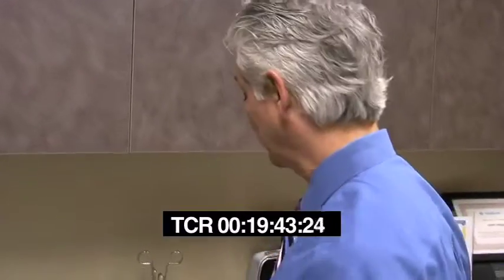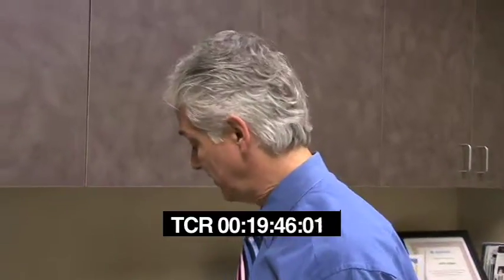Gotcha. Now, what's the ice for? The ice is for after we finish using the machine, it's pretty hot. Okay. We actually also use a cooling wand that cools the temperature of the skin down. We set it below 32 degrees. And that's actually cooling the skin while we're treating her with the laser. But after we've treated her, we'll take some 4x4 gauzes and put them in ice and then apply them to her face, and that helps cool it down. And most patients, after they go home, will take some Advil, but that's about all they really need. It's not a very painful procedure.